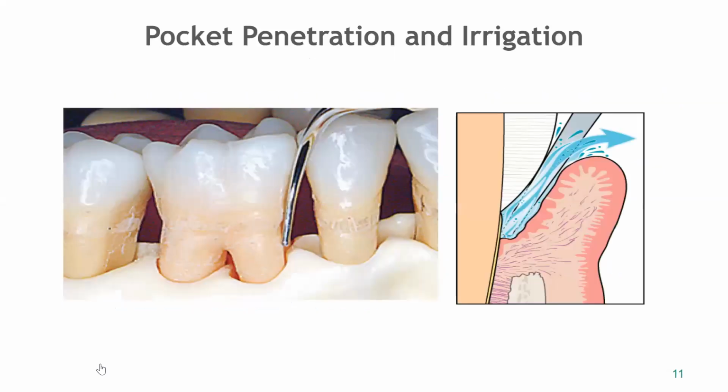Okay, so this is just a photo of an ultrasonic tip getting to the base of the pocket and flushing all that bacteria out.